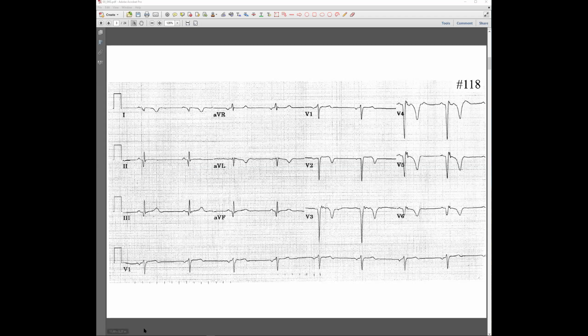Okay, let's see the next one. Okay, so far the first 3 were good. All right, I have to mark them. And George?